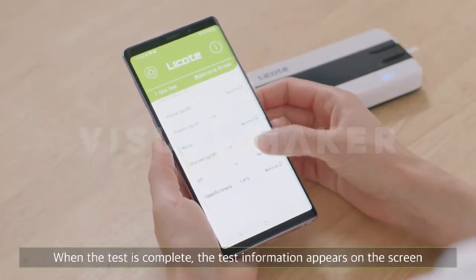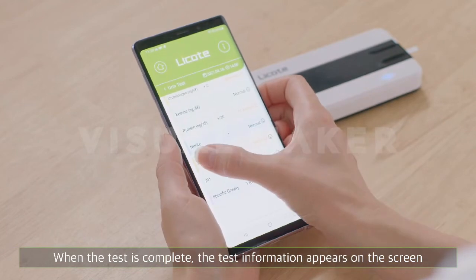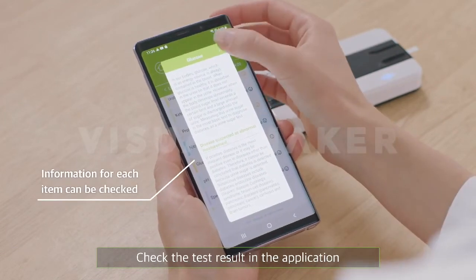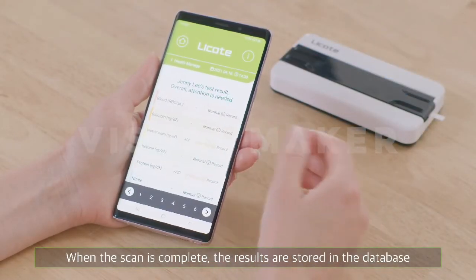When the test is complete, the test information appears on the screen. Check the test result in the application. When the scan is complete, the results are stored in the database.